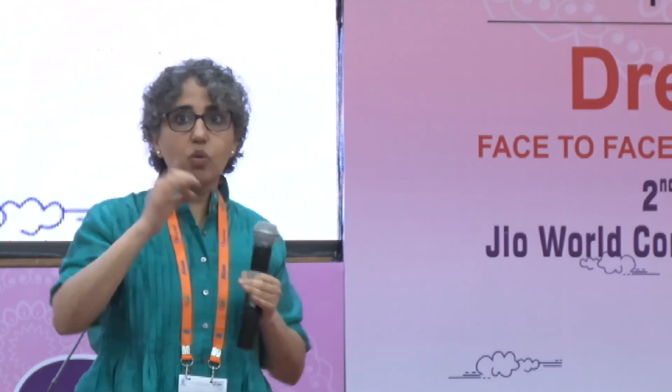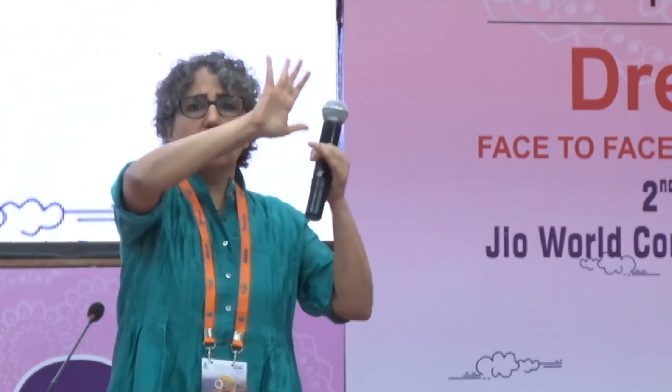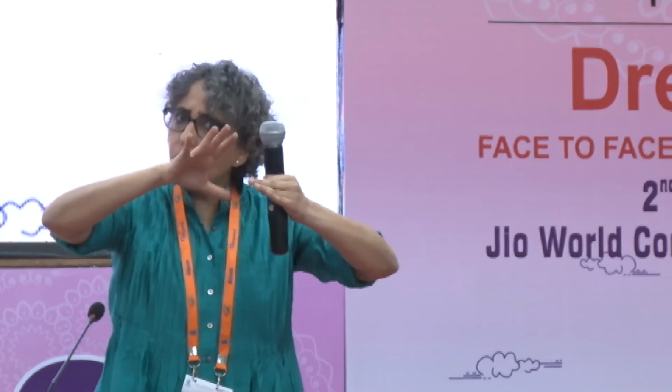So it's a moderate ganglion cell loss, no visual field loss. Would you treat? So again, as I said, all these moderate early values make no difference to me till you know what you're looking at. When you say moderate, where is my loss? Is my loss generalized thinning all over, like you get in a foveal thinning? Okay, then glaucoma doesn't cause that.